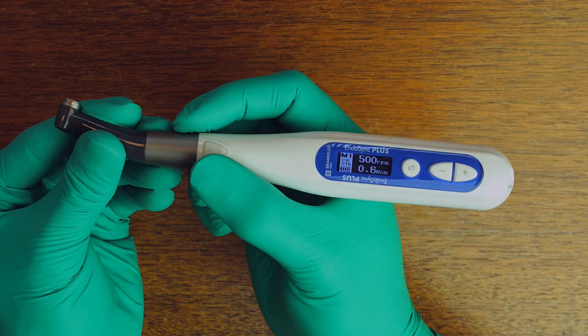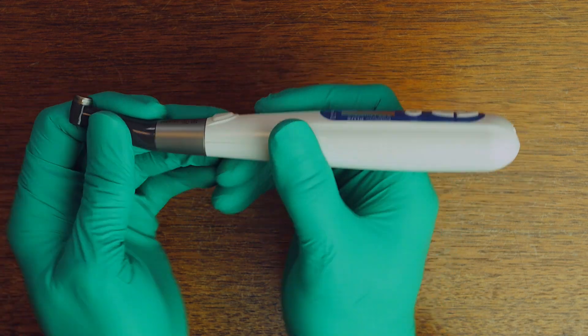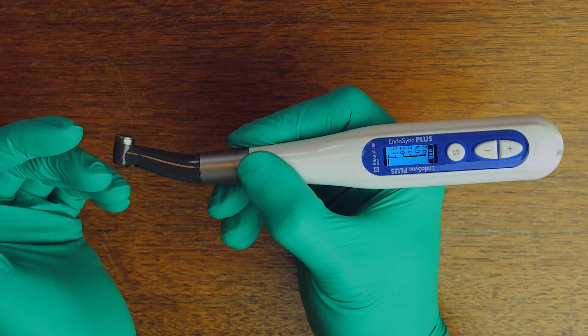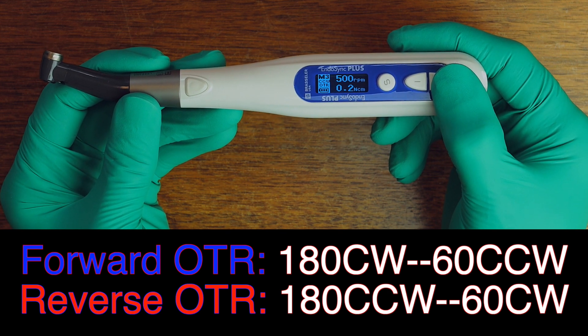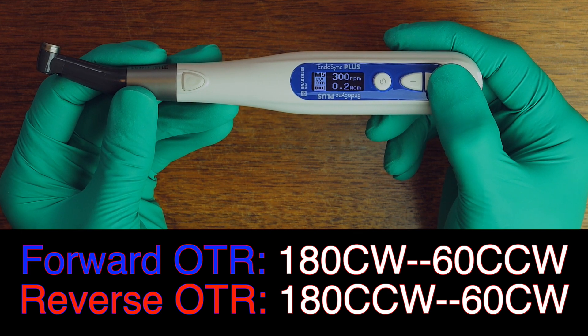You can program this handpiece to do OTR — or smart rotation — in either the forward direction for conventional files or in the reverse direction for all reciprocating files. Combined with its lightweight, cordless capability and its ability to sync with the Endosync AI's proven Apex Locator technology, you have a very powerful, fully customizable tool in your hands. For novice users with no interest in full customization, the handpiece comes with six pre-programmed factory settings, which I recommended based on clinical testing, covering the entire Endosequence line of files, the ESR, and even the 3D files. You can always overwrite and custom program your own personal settings over these presets if you prefer.